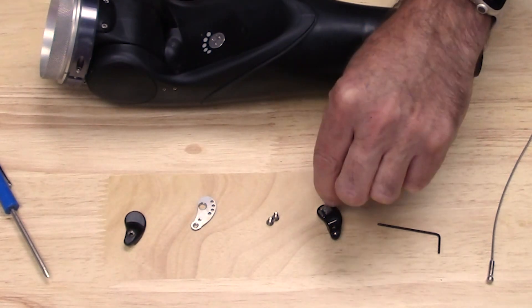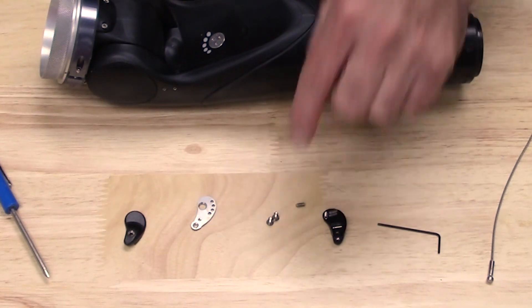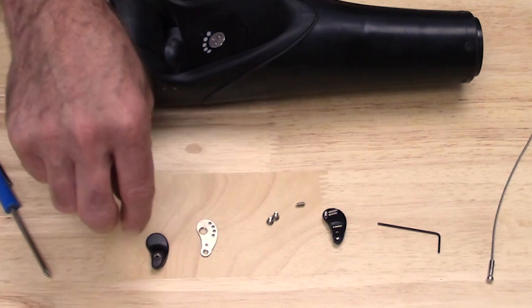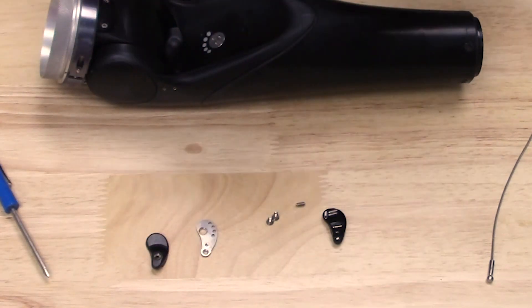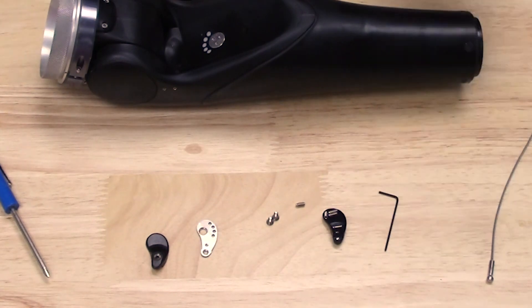In the kit, there's going to be five of these little set screws, there's going to be two Phillips head screws, and then you're going to have the rest of the lift tab assembly. It's also going to come with the installation wrench for those set screws.